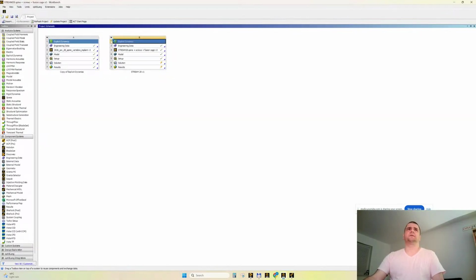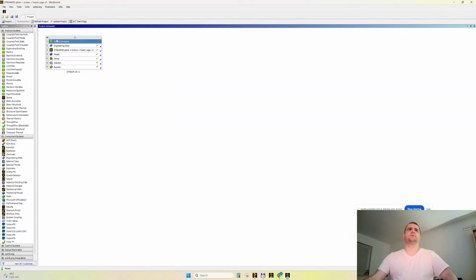Let's go here and delete the original simulation, duplicate this one. Let's close SpaceClaim. I don't want to work externally in another SpaceClaim session, because this will mean that I need to reapply some boundary conditions, let's say, upon the import of geometry. So I will edit this geometry in order to keep most of the boundary conditions. This is called a copy, I don't need to rename it. Double click.